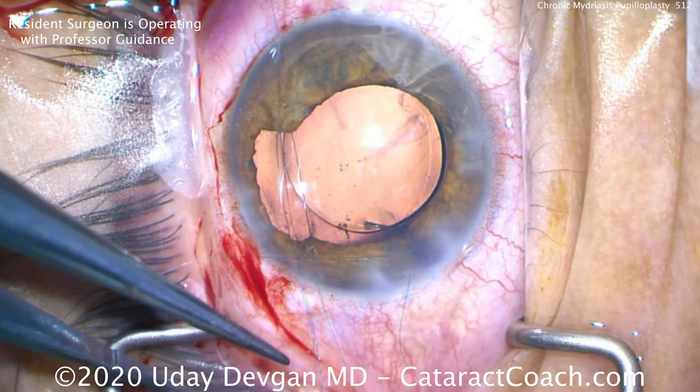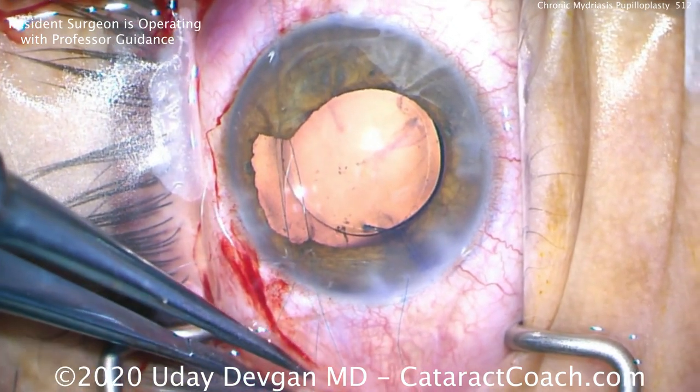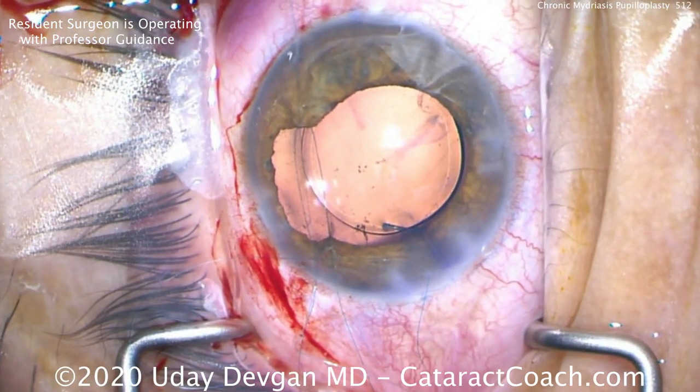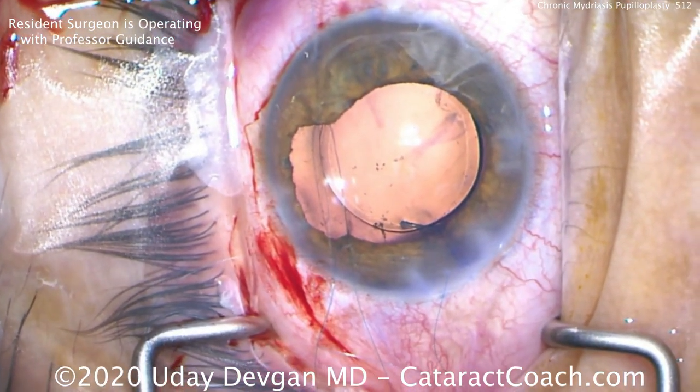The four-throw pupilloplasty. So now getting the loose end, put it through this loop four times: one, two, three, four.